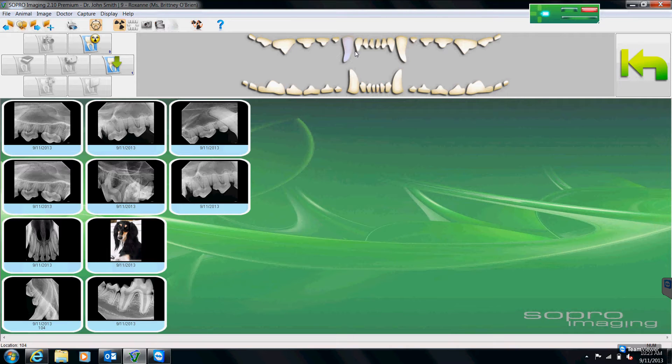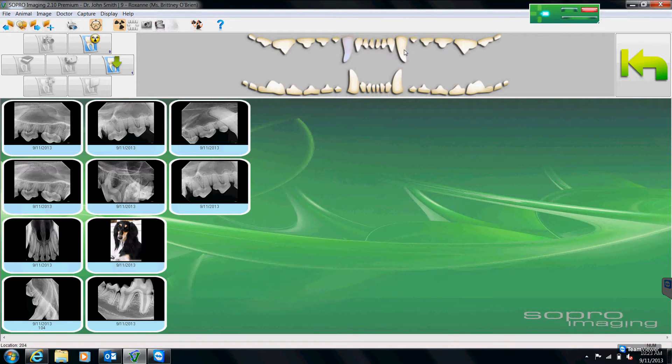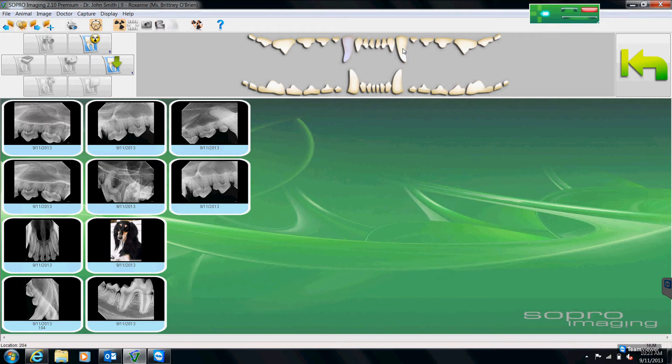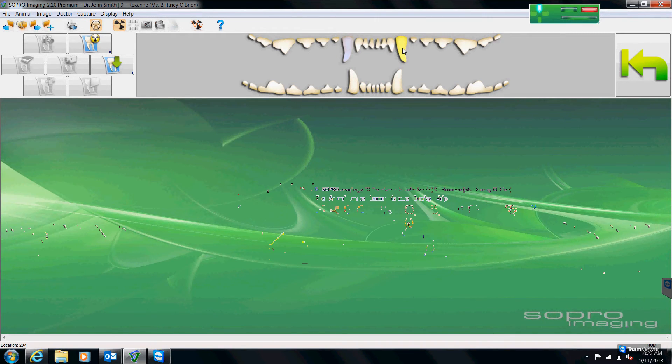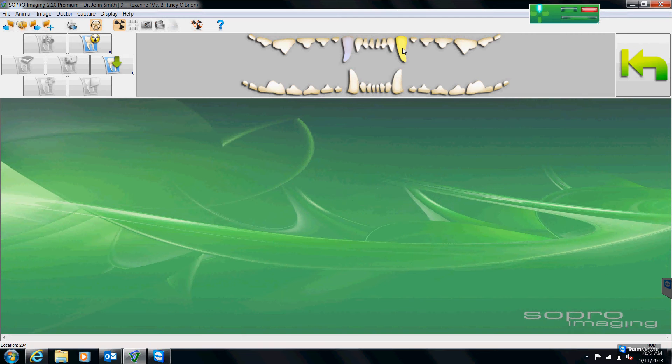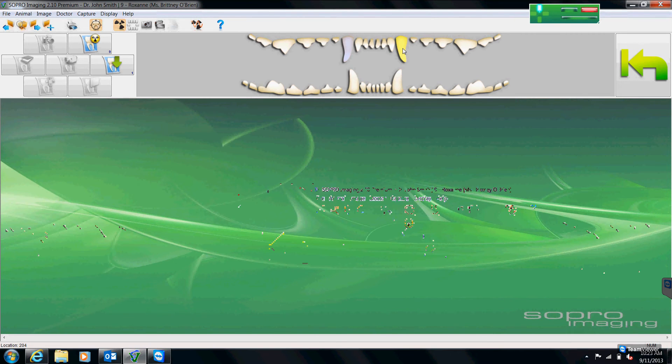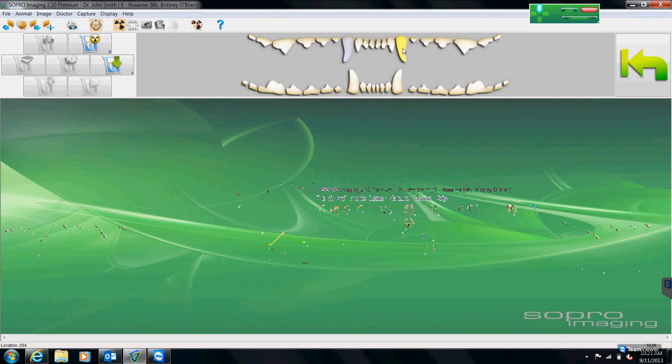Another way that I can go about numbering my teeth is that I can number as I shoot. So if I'm about to shoot this 204 canine, I can click on that tooth and it will turn yellow. And if I were to shoot my x-ray right now, it would automatically number that image 204 for me.